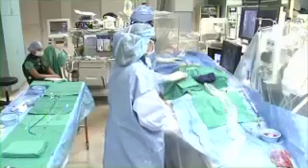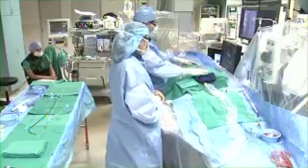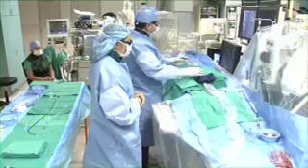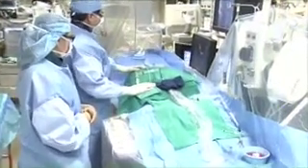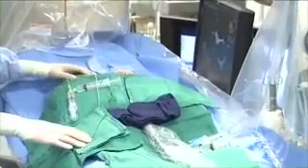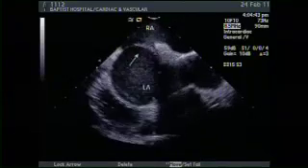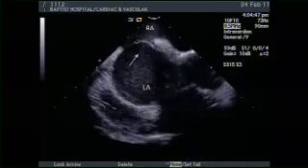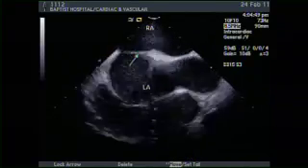Okay, welcome back. So here we have two introducers, one in the right femoral vein, it's a big vein, and another one in the right femoral artery. There is a catheter inside the heart, as you can see there, that is an ultrasound. And with that ultrasound, I'm looking at the heart. Can you show the ICE images, please? So there, Dr. Machado will tell you the chambers of the heart and where the defect is. Ralph, can you go ahead, please?